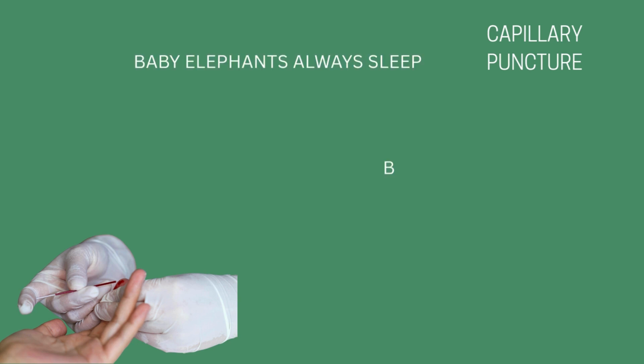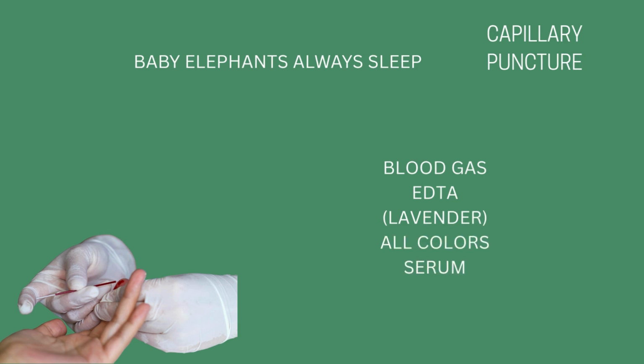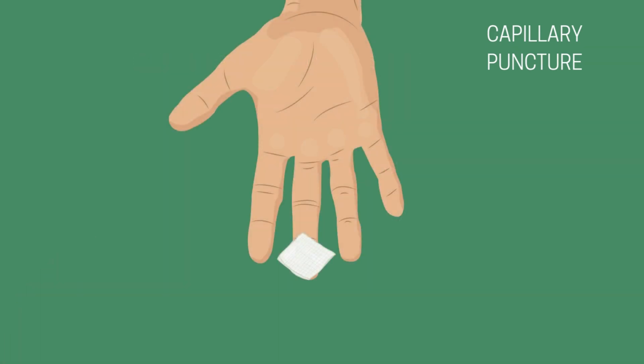The first tube collected is a blood gas, followed by an EDTA tube or lavender-colored tube. Next up is any other colored tube and then serum tubes. You can use the phrase, "baby elephants always sleep." After you have collected the sample, apply pressure with some gauze over the site of the puncture. Most bleeding will stop quickly in 30 seconds to a minute, but some people may bleed longer for up to 5 minutes. Make sure the bleeding has stopped before you place a bandage over the site of the puncture.